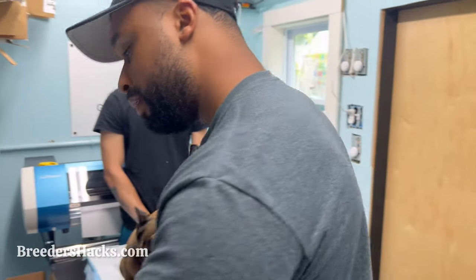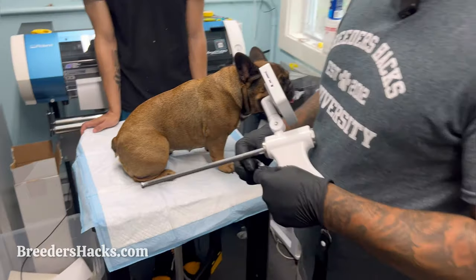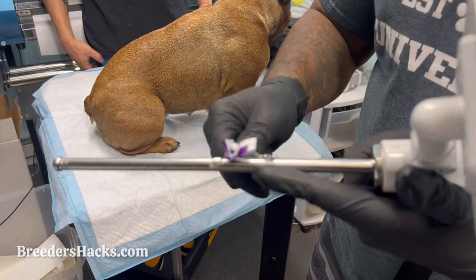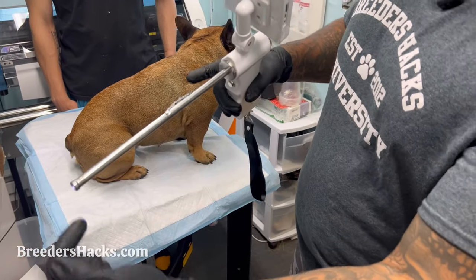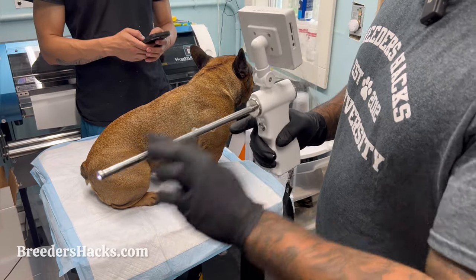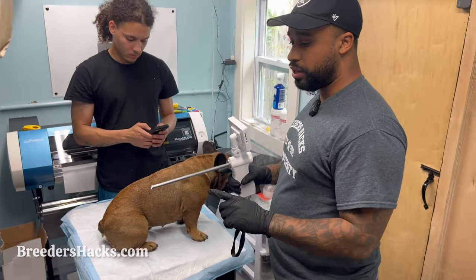We're going to put this down and start working relatively quickly. Turn our unit on and take some lube. The key thing when putting the lube on is you want to put it along the stem of the unit, but you really don't want to put too much toward the front because then your camera won't be able to see anything. Run it along the sides and hit the very end, but don't put any on the inside because that's where your camera is. Just a light coating — and now you have enough on your finger to go into the female.